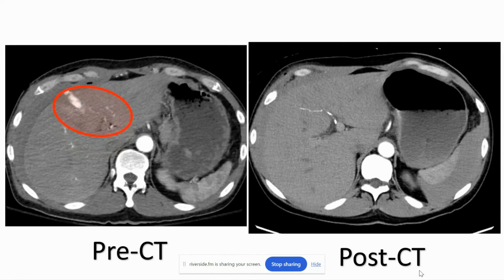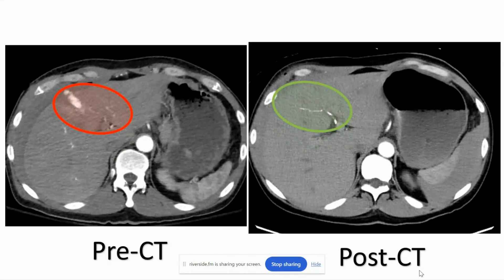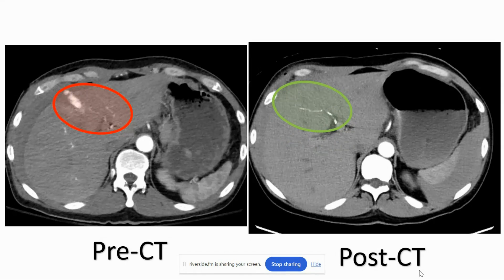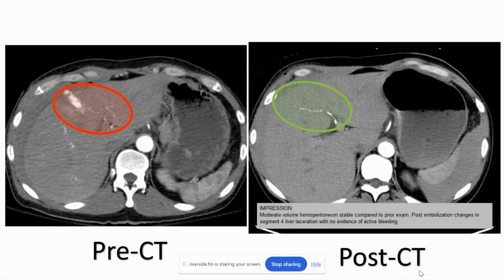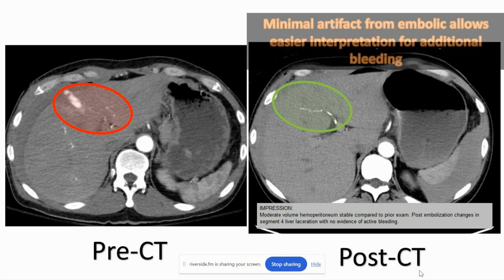This is the CTA on the pre-imaging. This patient ended up getting a CT along their care for other reasons, and you can see the Obsidio looks like very dilute contrast. You don't get that streak artifact that you would get with an Onyx-type material or even coils sometimes. And you can see post-embolization changes with no bleeding.